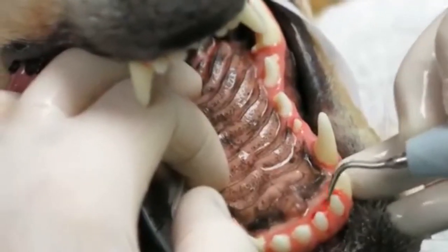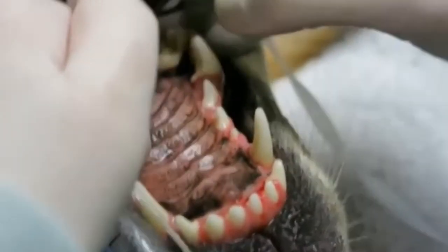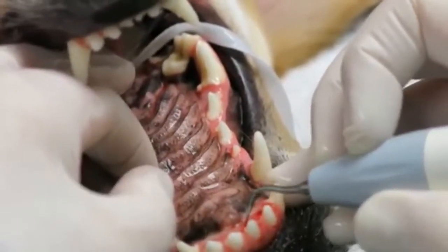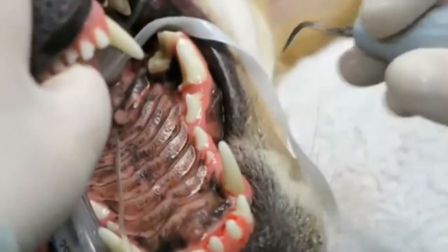As you can see, after ultrasonic scaling, we actually have quite a bit of bleeding. Even though this dog has had fabulous home care, we've still got some bleeding and some gingivitis. So it's a good thing to be cleaning these teeth at this point.